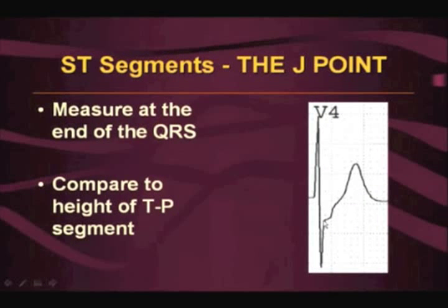We had an EKG guru who said read it at the takeoff. I actually contacted the new editor. When I asked the cardiologists, they all referred me to the current editor of Marriott's, and he said that you read it at the takeoff. There's evidence if you read it 2 small boxes later, it loses its sensitivity and specificity. So measure it at the takeoff. So what is the takeoff? How do you know where the ST segment starts? Well, you look at the QRS, and the QRS should always be a nice, straight line.